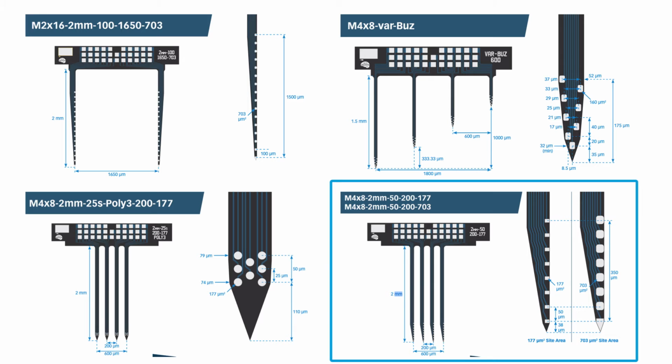We don't label our different probes as impedance. This is a low impedance, this is a high impedance. We look at site area. And what I learned, if you just look at these 2 examples, small electrode versus a large electrode: a small electrode will give you higher signal to noise ratios, initially. So those are recommended for short-term implants. They'll give you the best signal to noise. You're talking about action potentials. Yeah, action potentials.